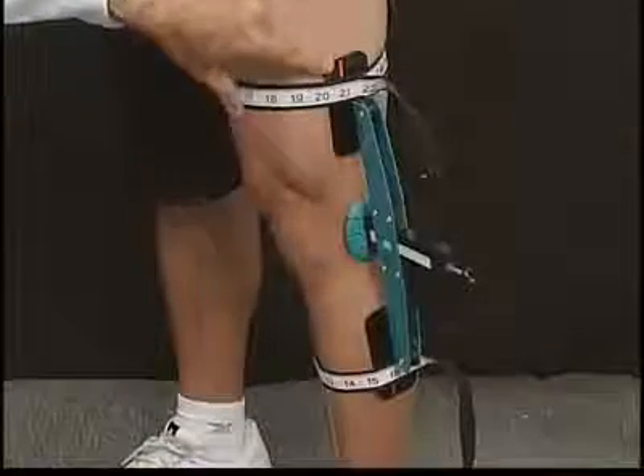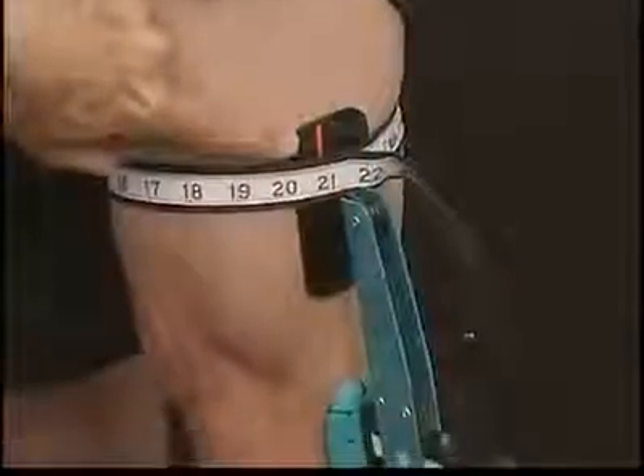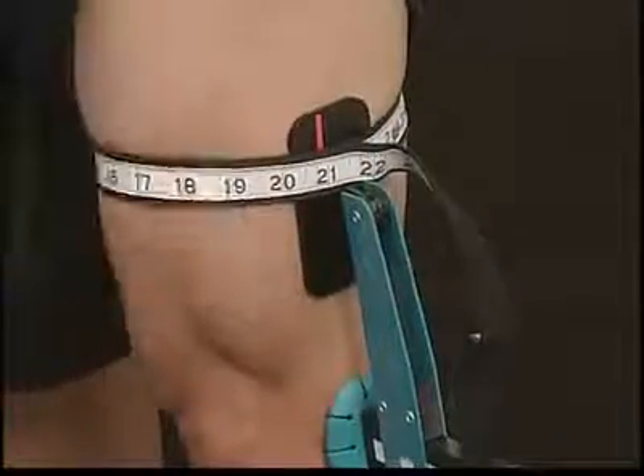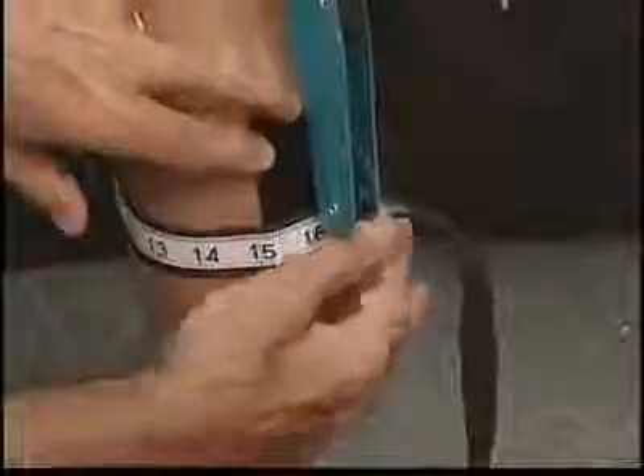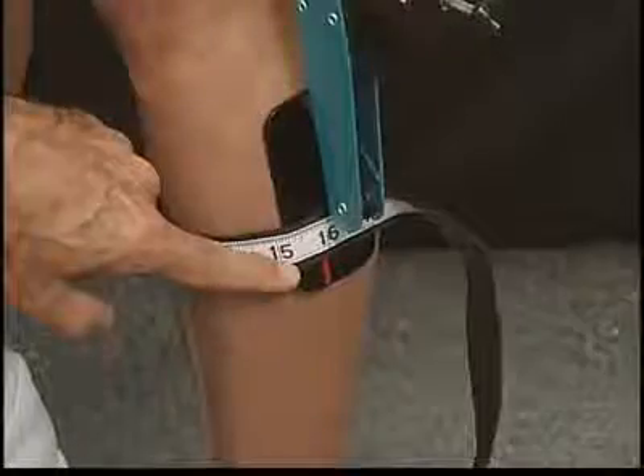Use the red mark on the gauge's side to obtain your thigh circumference measurement. In this case, the measurement is twenty and seven-eighths. Move down to the lower tape to obtain the calf measurement. In this case, it's fifteen and seven-eighths.